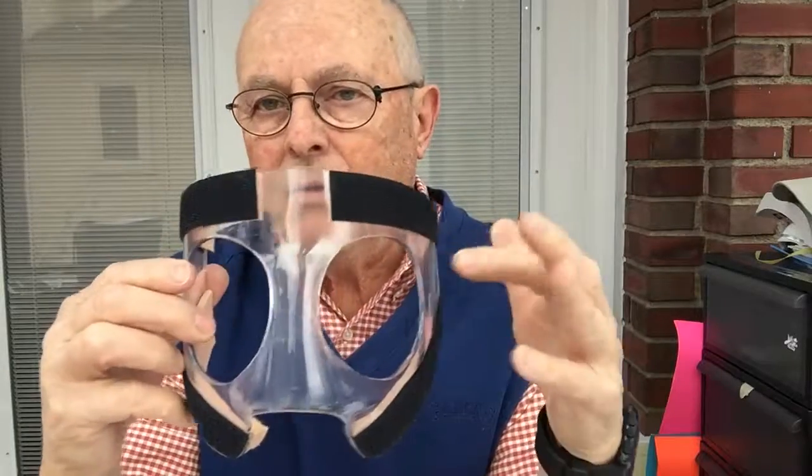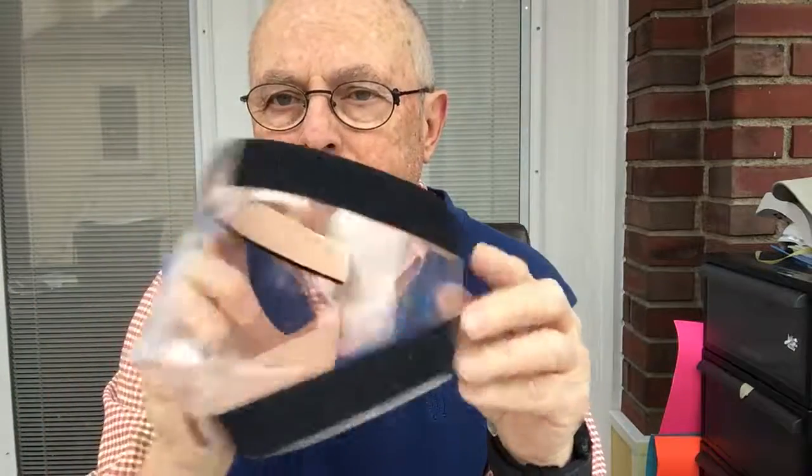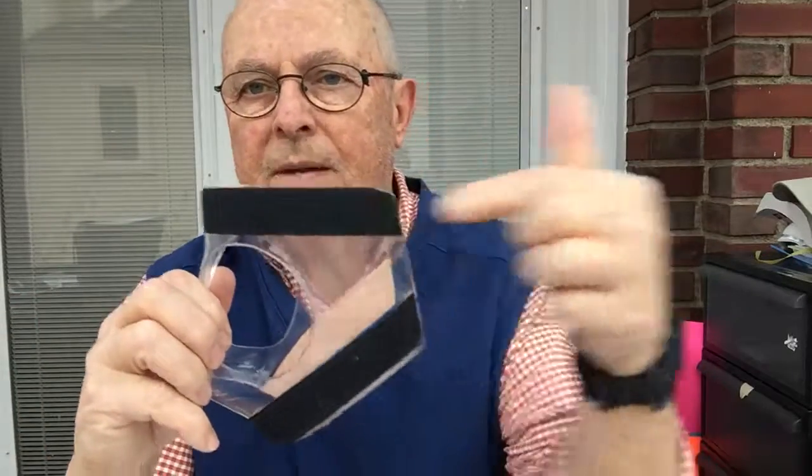Big eye holes, no vision obstruction whatsoever. Super lightweight. Internal pads are Moleskine — very comfortable and it won't slide on your face. Just two straps that go straight across from here. Multiple locations for attachment.